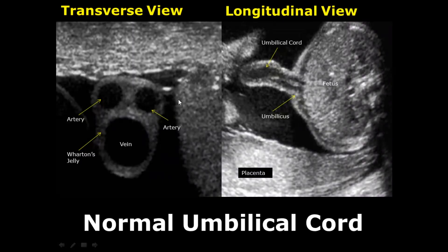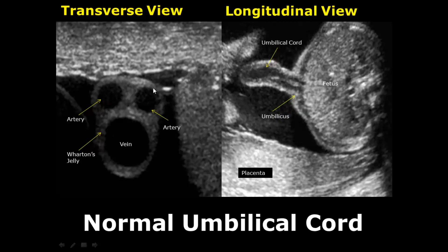The umbilical cord connects the placenta to the fetus and provides blood supply. Here we can see a cross section of the umbilical cord in the transverse view. The one with the larger diameter is the umbilical vein, and these two with smaller diameters are the umbilical arteries — so we have two arteries and one vein. The umbilical cord is protected by a substance known as Wharton's jelly.